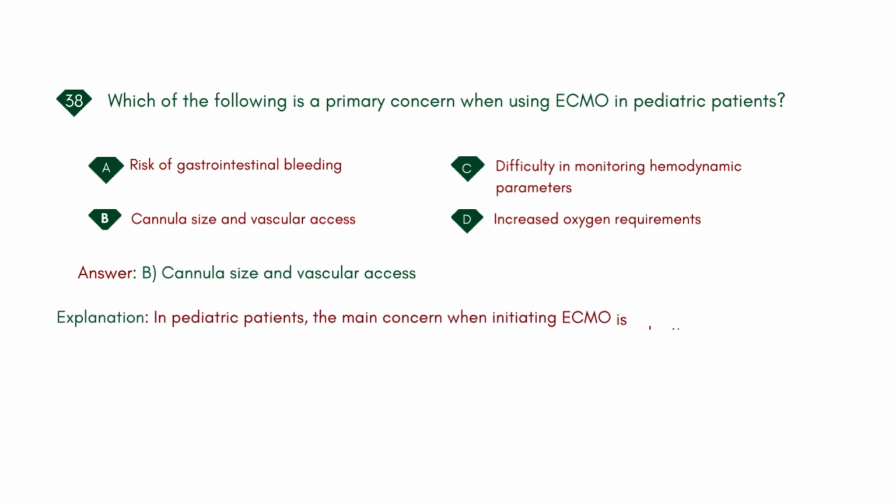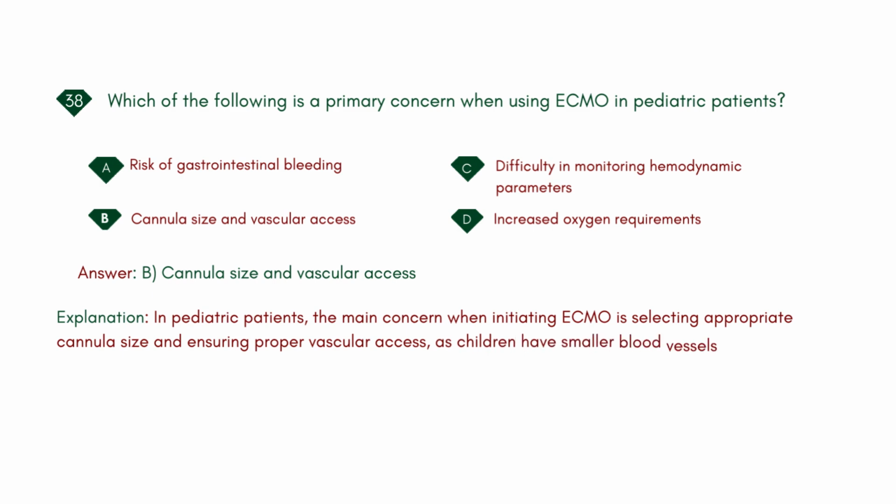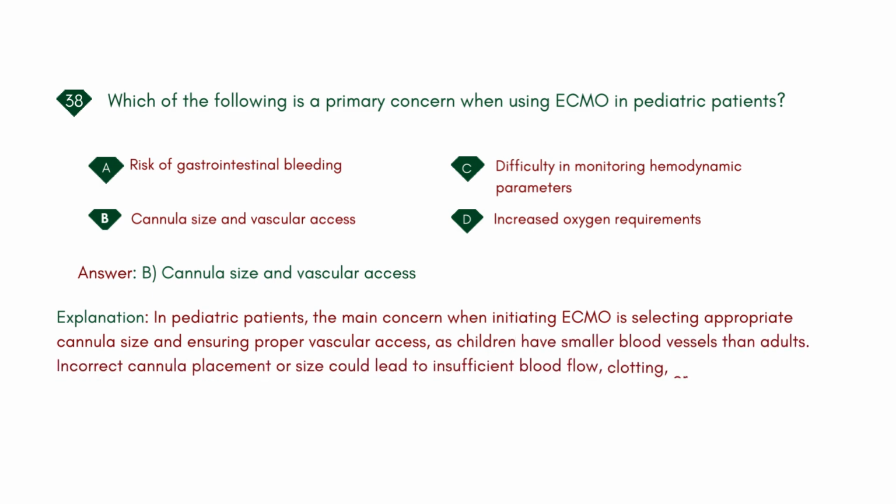Explanation: in pediatric patients, the main concern when initiating ECMO is selecting appropriate cannula size and ensuring proper vascular access, as children have smaller blood vessels than adults. Incorrect cannula placement or size could lead to insufficient blood flow, clotting, or injury to the blood vessels.